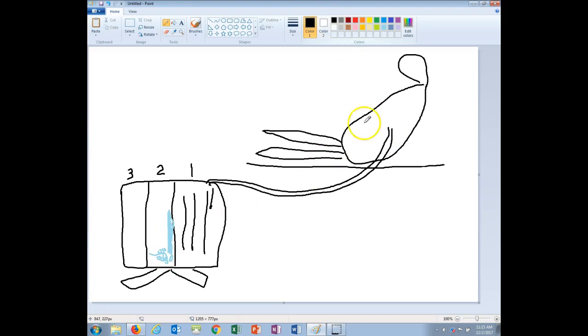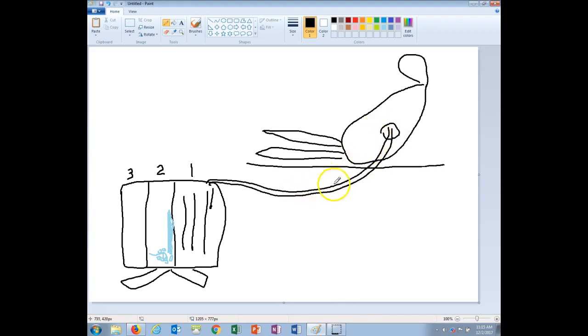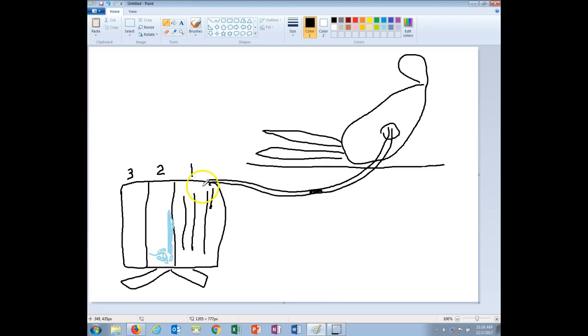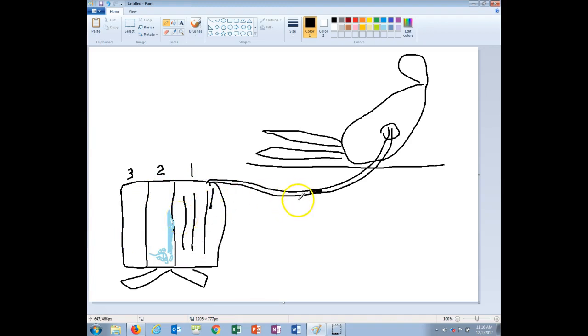So the leak could possibly be here where it's connected to the patient, somewhere along the tubing, and there is a part where it is connected here to the valve, so you might want to check here or somewhere along the ways, and even if you get to this area it might actually be in the unit itself.